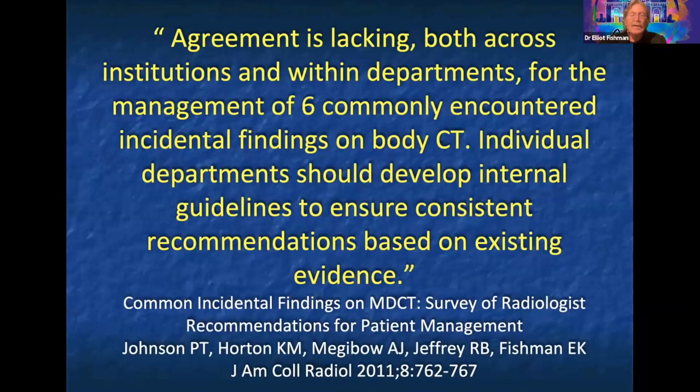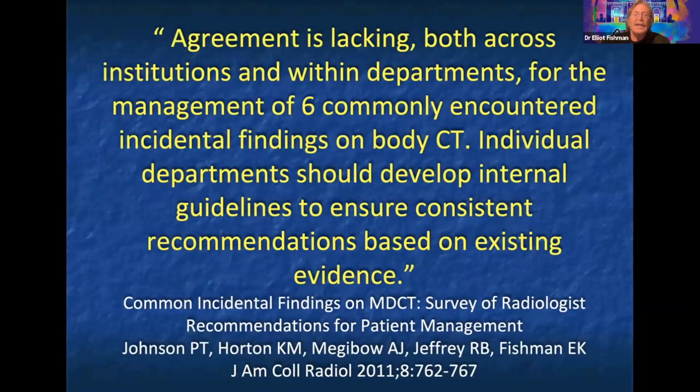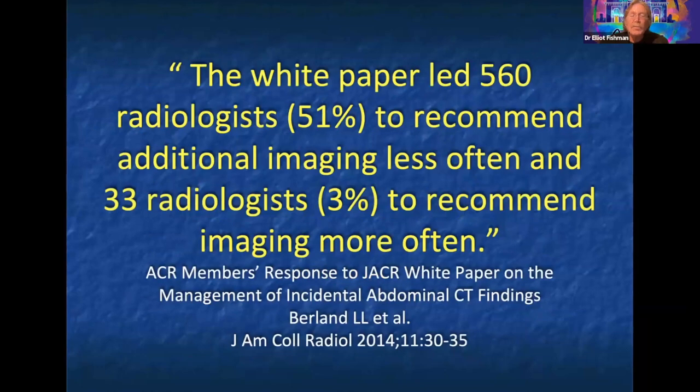Now, we talk about cystic pancreatic lesions. I mentioned that. I also mentioned the fact that it's important to have agreement. Surely it's great if all of radiology has agreement, but I think it's important that within your own department, you have certain rules.